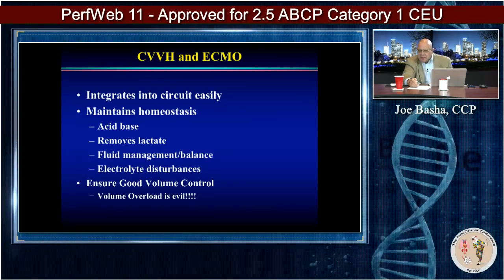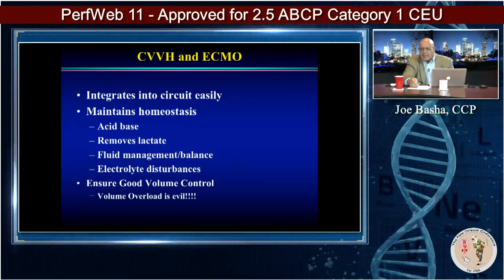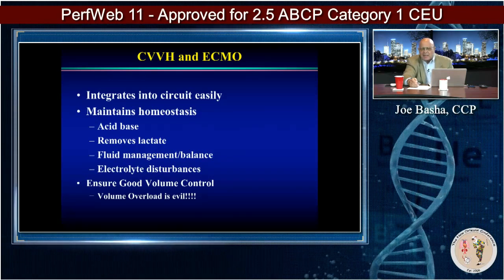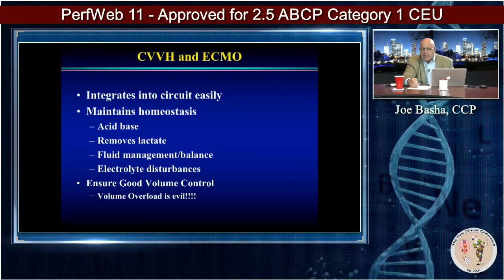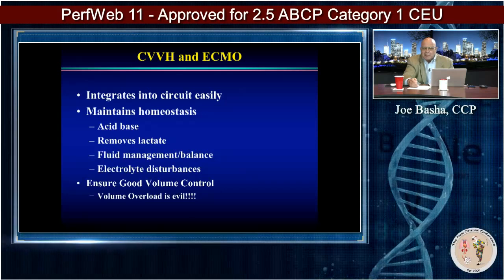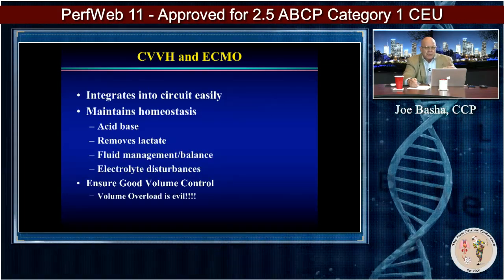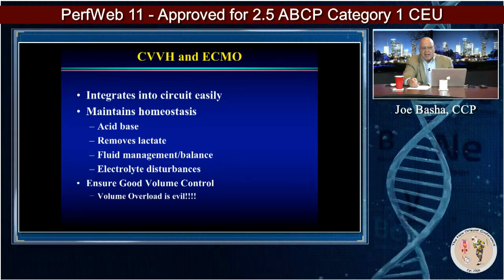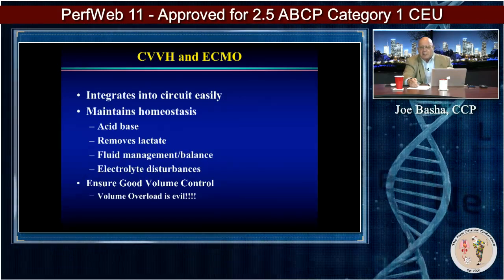CVVH and ECMO is really interesting because you can integrate it directly into the circuit. And it's very beneficial, which I'll show you, in maintaining homeostasis, acid-base balance. It removes lactate, fluid management and balance, electrolyte disturbances it can correct, but it does it over a longer period of time. It doesn't have to be done in a 2, 3, or 4 hour period, as is the case with traditional intermittent hemodialysis. And again, I was going to say it twice, ensure good volume control.